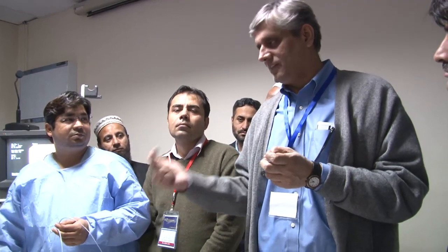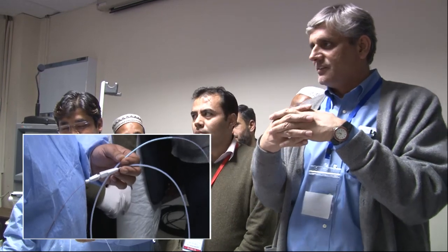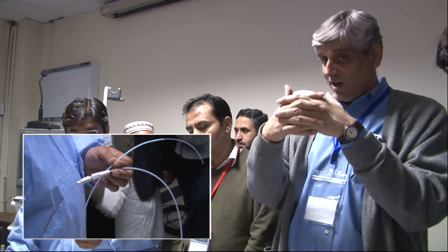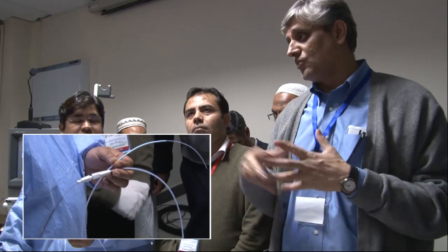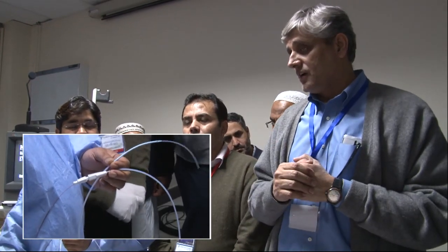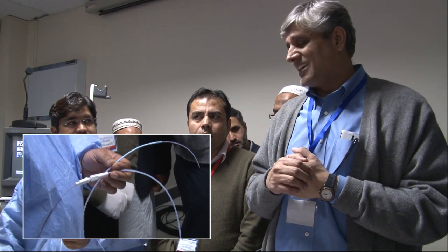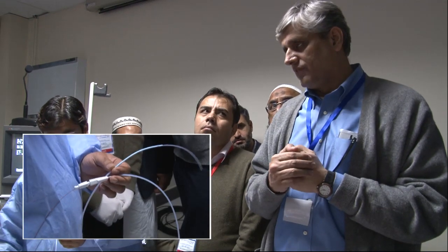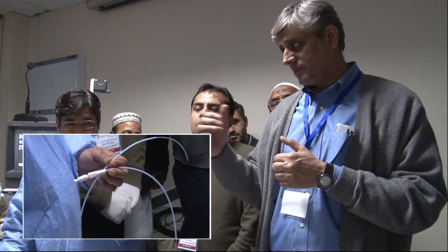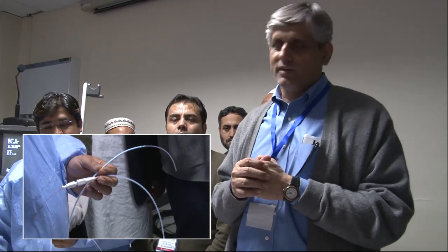And he, in fact, tells me, shall I do it? Or vice versa. So you should have so much understanding with your tech that they should know what you are going to do or what you're supposed to do, and I should know what he's supposed to do. I can't emphasize it more. If you don't have somebody next to you who understands what you're doing, sometimes you're going to be stuck.